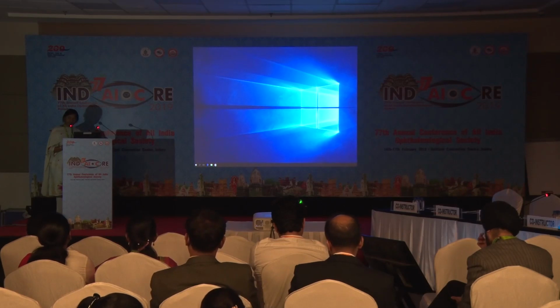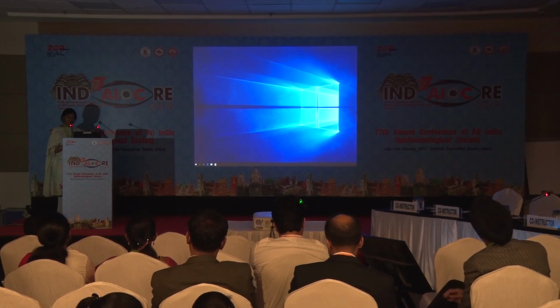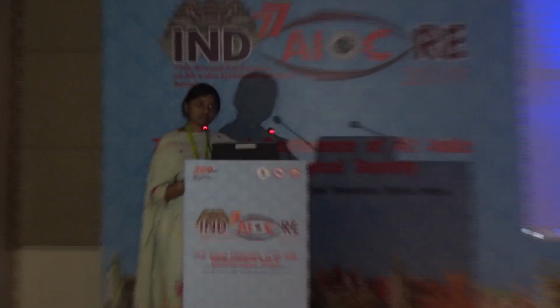The initial corneal tear repair we do as soon as the patient comes in. Usually, even if it is a Sunday, we prefer to take up the surgery on the same day, as far as possible. But regarding the IOL placement, it always depends. We should think, and if everything is okay, then we can place it at the same time.